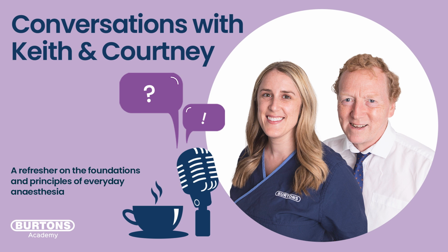Yeah. So I think we've covered a few things. One thing maybe to think about now is, if you did have access to a blood gas analyzer, what could you look at on there that would give you an indication of something being awry? So you suspect a hypoxia, you suspect that your oxygen saturation that your pulse ox is telling you is poor. If you had blood gas analysis, then that would give you more information and more weapons to prove this problem.